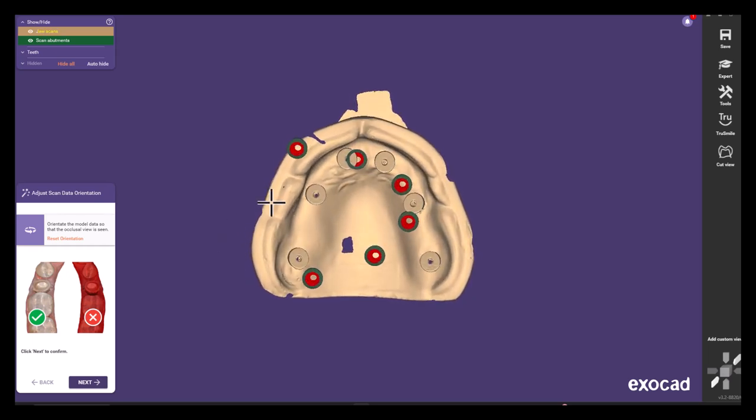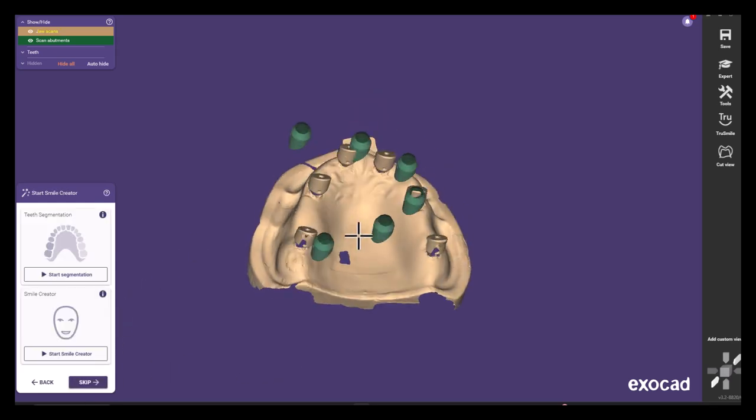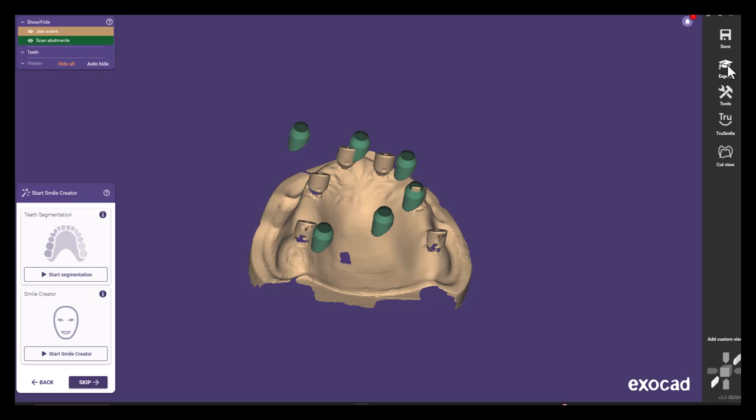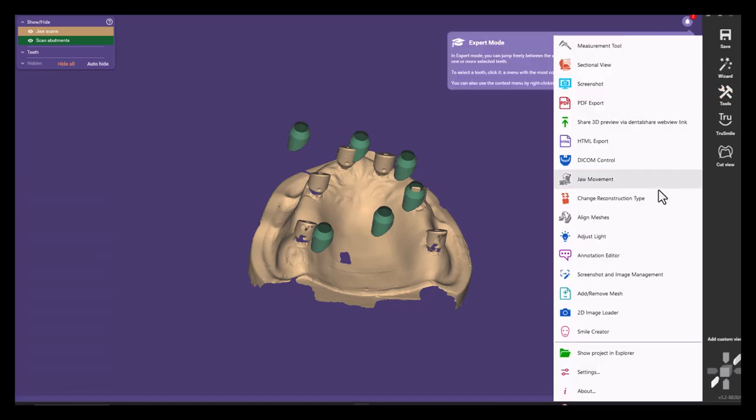First off, set the scan data orientation such that the red on the intraoral scan is not visible and hit next. We will then switch gears and load the expert mode.